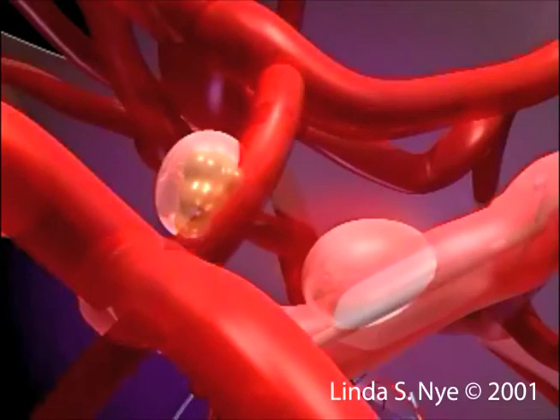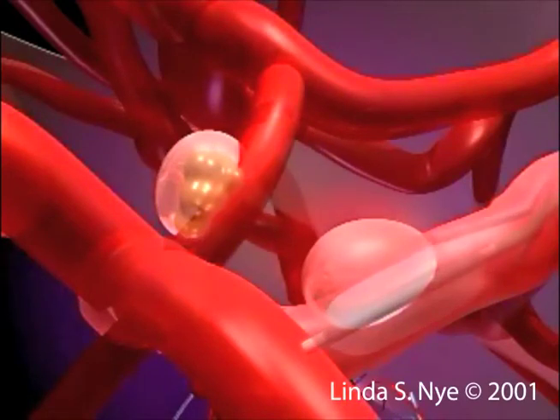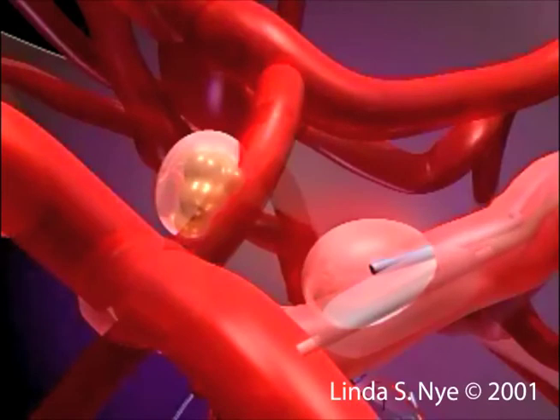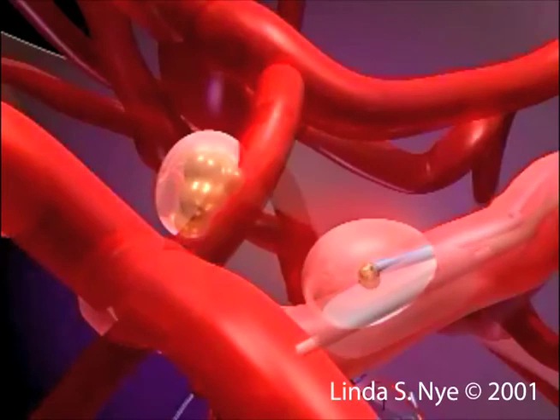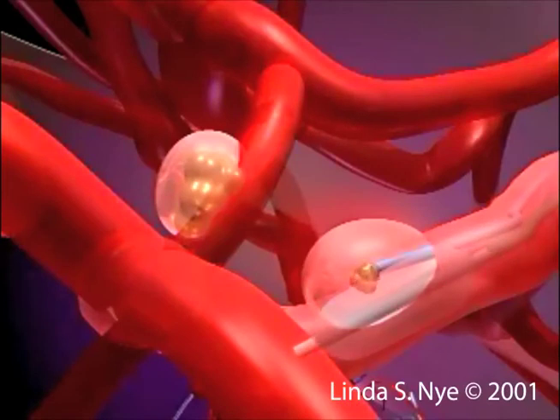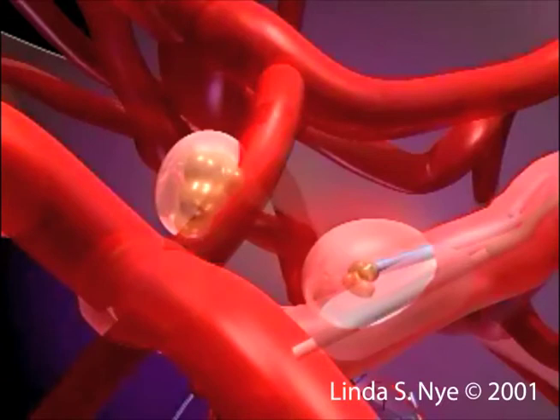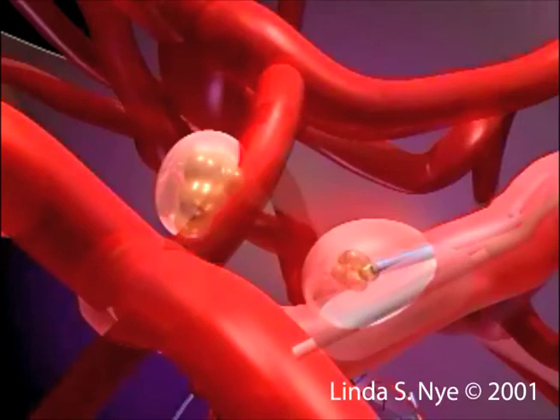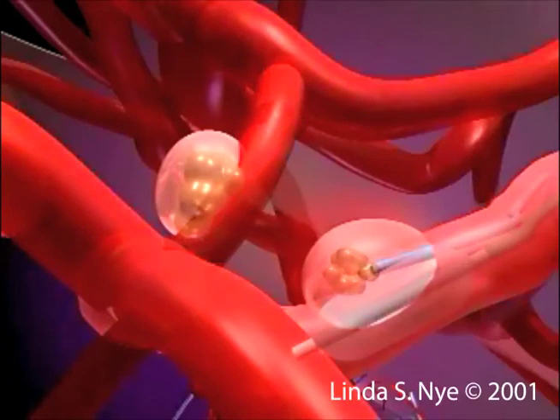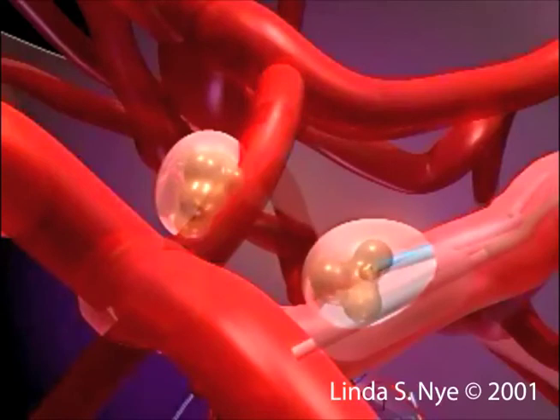Once the balloon is in place, the clinician positions the tip of the microcatheter at the center of the aneurysm and injects the mixture. This liquid polymerizes on contact with the blood, filling the aneurysm and isolating blood flow to the diseased area.